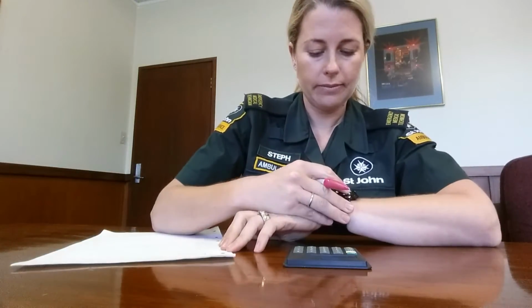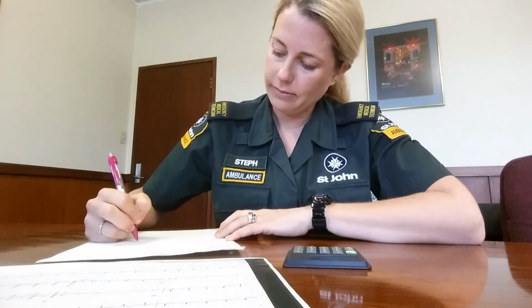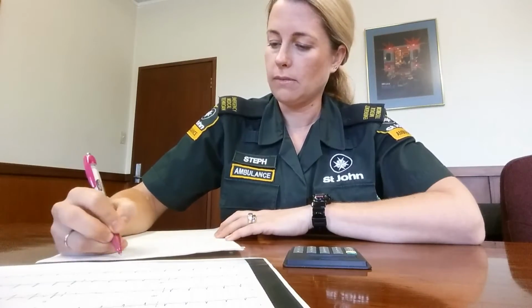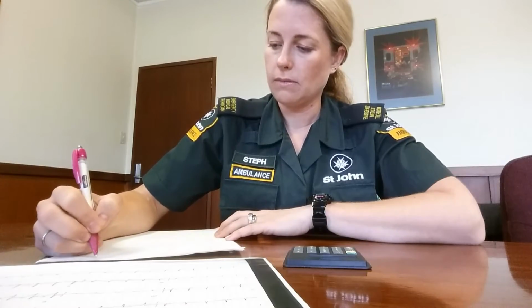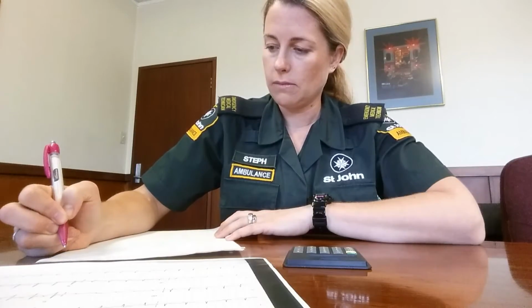Okay. I'm going to hand you an ECG. If you could read out the number of it, which is on the bottom. Okay. Number 4. Right. And I'm just going to give you a short history. I have a 56-year-old male playing tennis. He developed sudden central chest pain and vomited. Conscious collapse, witnessed, non-injury. An opponent called the ambulance. The patient is pale and sweaty. He'd been playing for 20 minutes and he has 7 out of 10 chest pain.